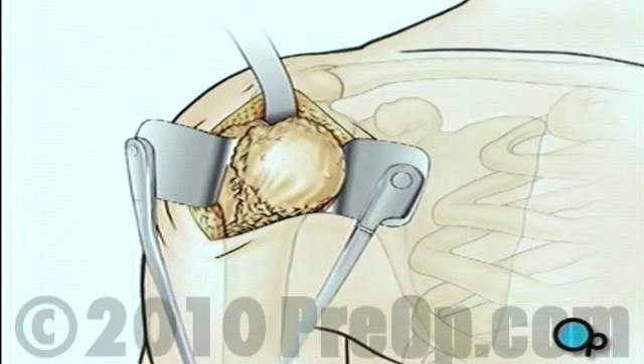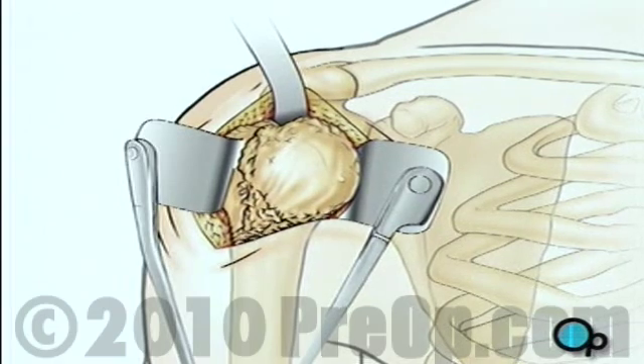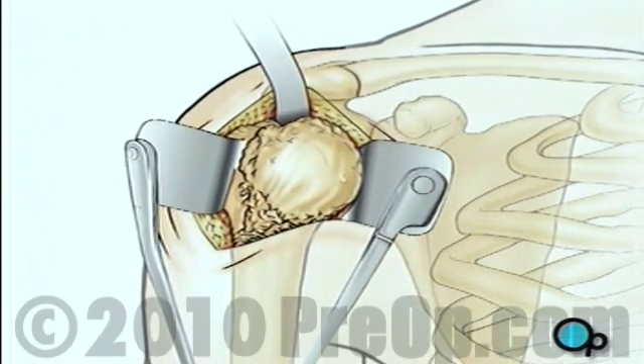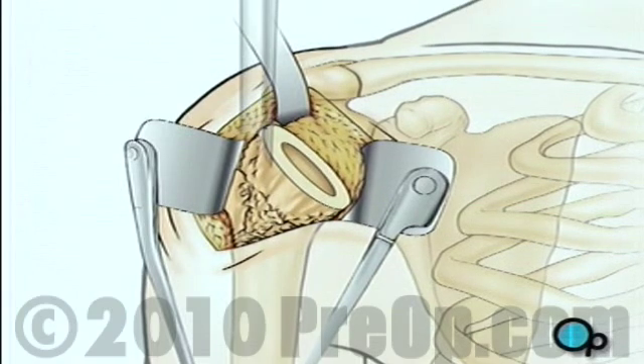Next, the team pulls the top of the arm bone out of the shoulder socket. Using a precision surgical saw, your doctor will carefully remove the ball-shaped end of the upper arm. Then the surgical team will use a high-speed drill to hollow out the top of the arm bone.